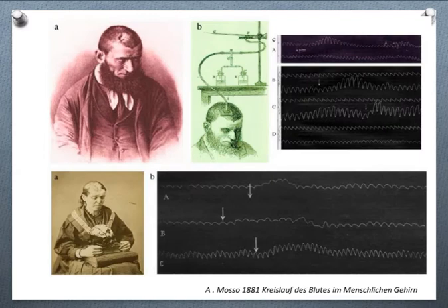Measure ICP is an old story. One of the first recordings has been done by an Italian, Mosso, 1881. He recorded in patient, in subject with skull defect, the ICP, and he was able to notice that activity did produce changes in pressure. And he hypothesized, 1881, that the change was due to a change of the flow. So we are talking about a very long history.